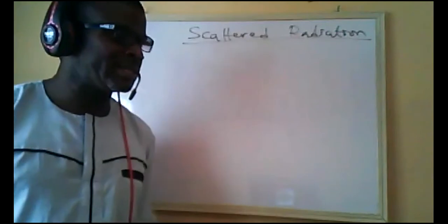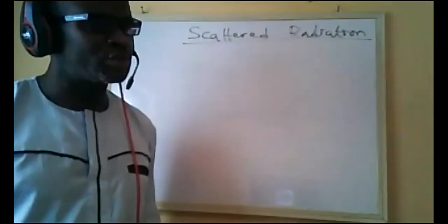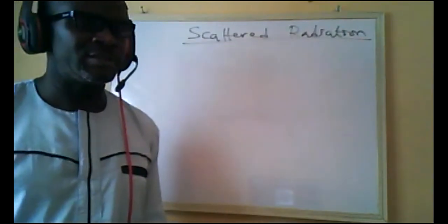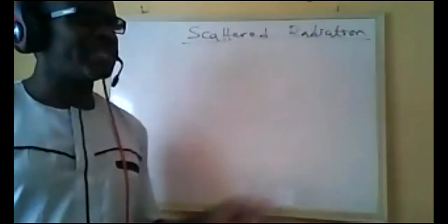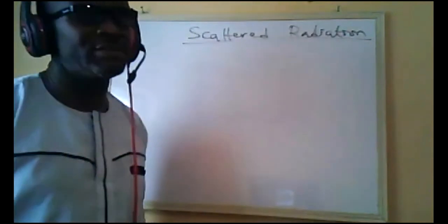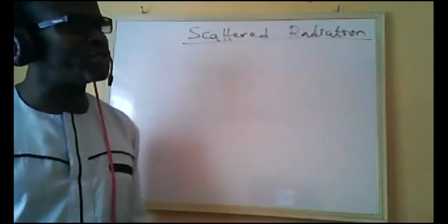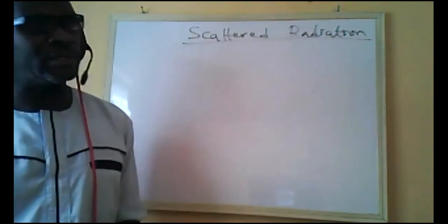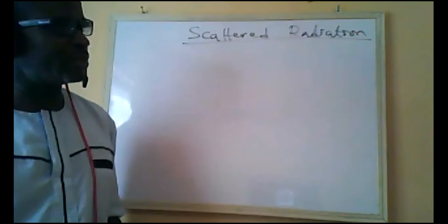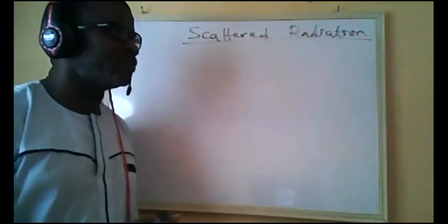But unfortunately, it can't be eliminated, especially when the kVp begins to be elevated past 50. Compton scatter predominates as the kVp increases in soft tissue, whereas at lower kVp the photoelectric emission predominates, as it goes from 40 upwards, even up to many megaelectron volts.